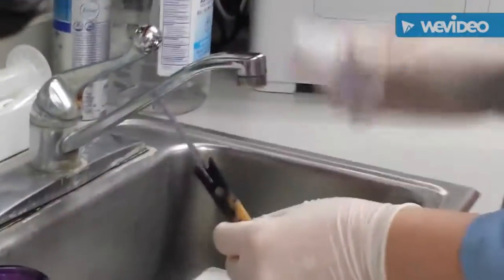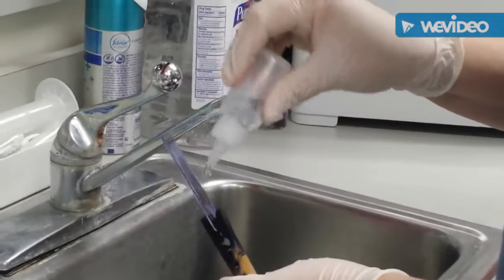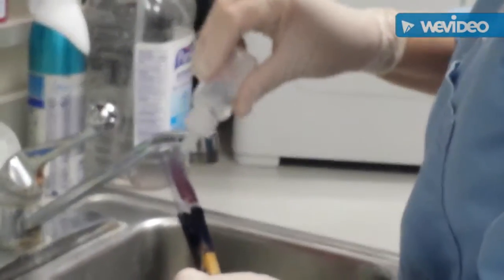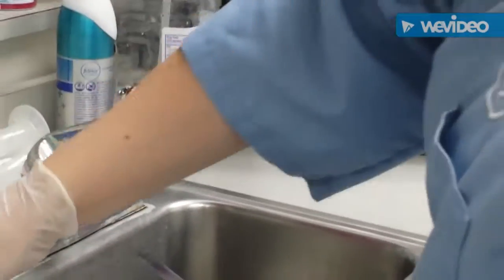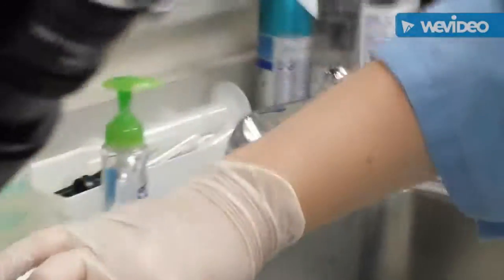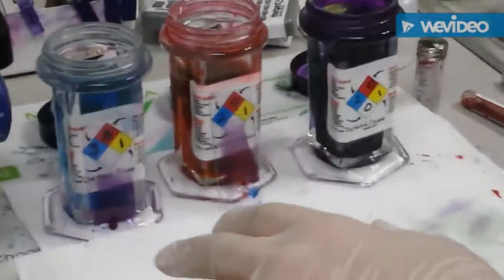Again with the butt, which would be a frosted edge if we had one, down, but like I said, we have labeled these with our patient's name, so we're able to know which end is down. And so we're going to place that one right there, and we're going to let those dry, and then as soon as they're dry, we'll be back for the next step in our video.